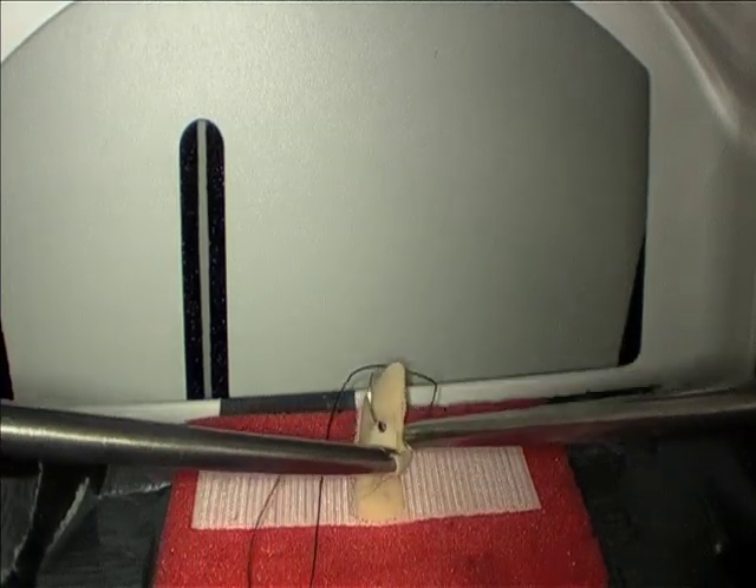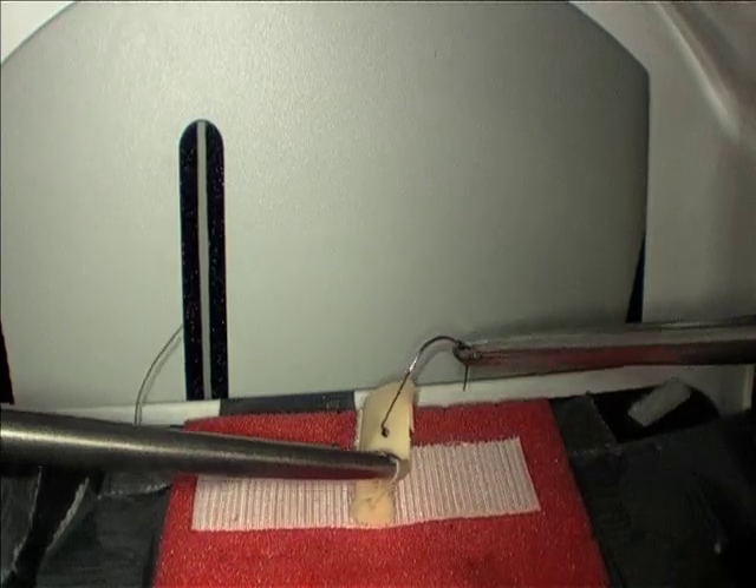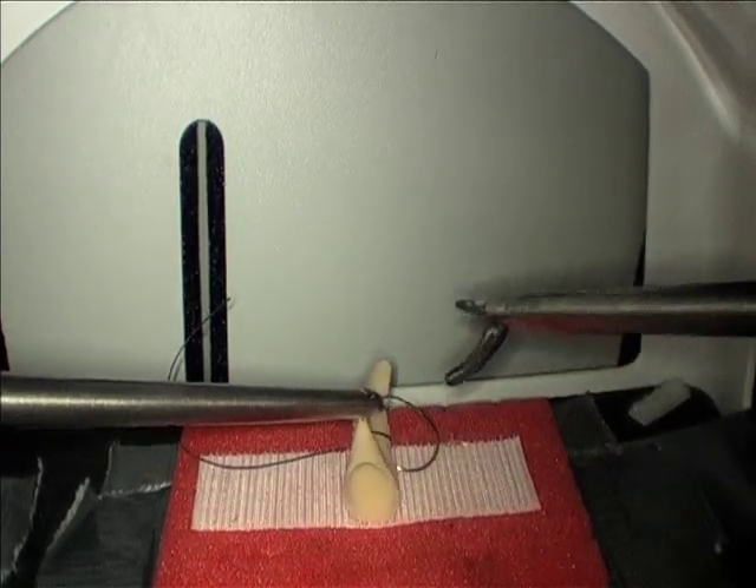Next, bring the needle through the tissue, remembering to roll your hand so that you don't drag the needle, but instead bring it through smoothly.